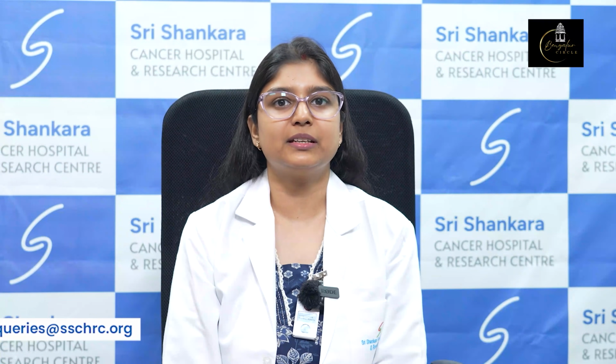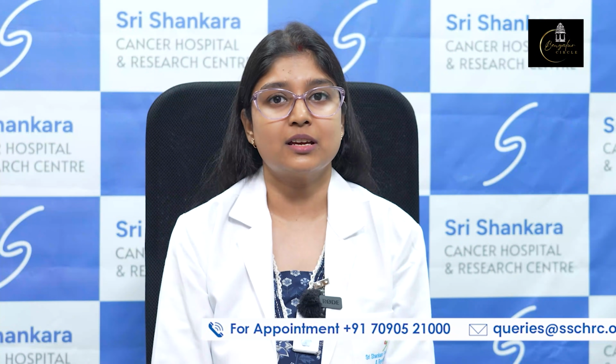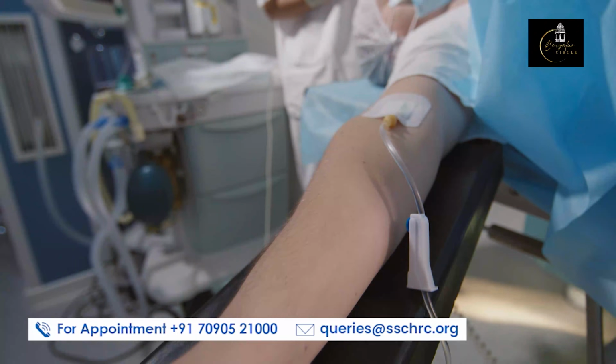Nuclear medicine can be divided into subgroups like diagnostic nuclear medicine and therapeutic nuclear medicine. So in diagnostic nuclear medicine, we have PET-CT and gamma camera imaging. PET-CT is a very commonly done procedure in cancer patients. The most common radiotracer used worldwide for PET-CT is FDG, the full form being fluorodeoxyglucose. It is a glucose analog and this FDG is injected into the patient through an IV line, that is, intravenously.